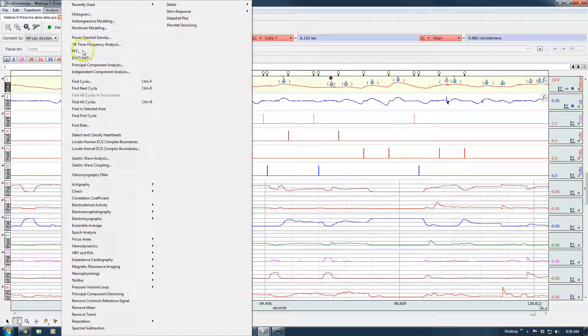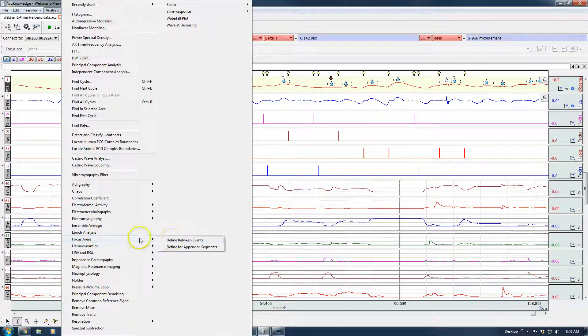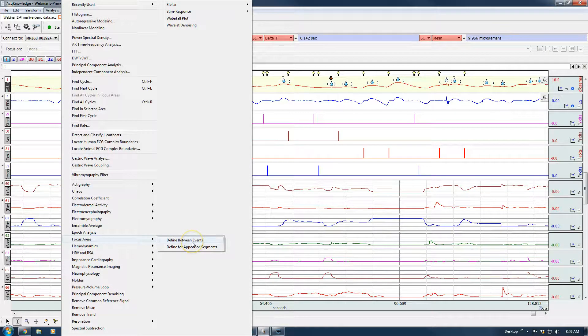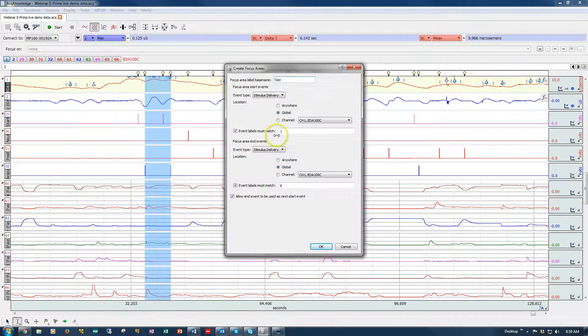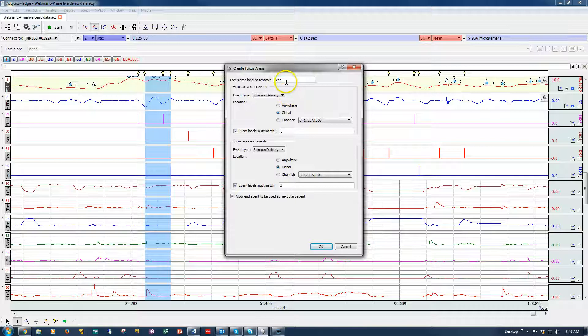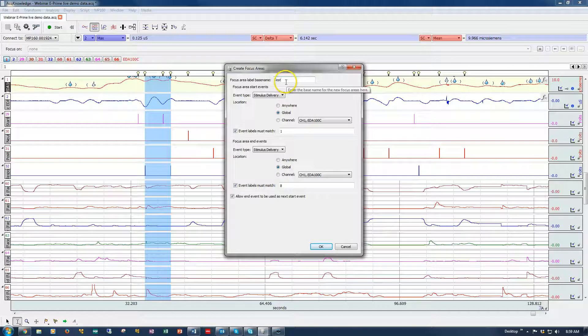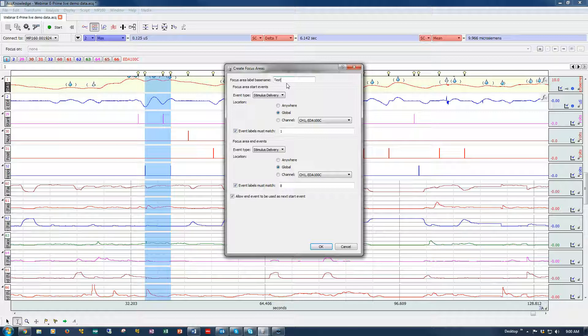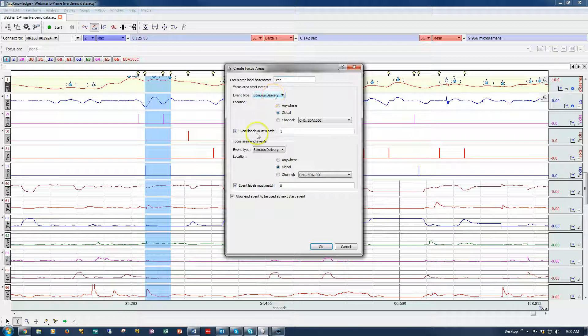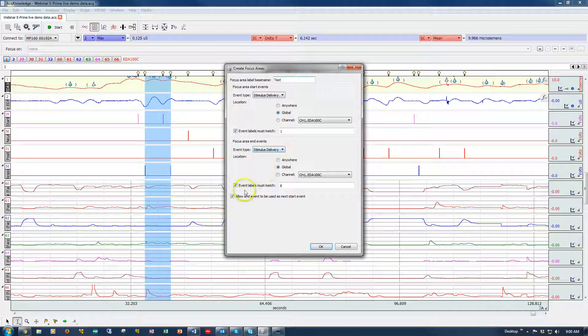So again, we're going to the Analysis menu, Focus Areas, Define Between Events. I'm entering a label. This is the label that will appear in each of the focus areas and it will number them. So it will say Test 1, Test 2, Test 3, so on and so forth. Stimulus delivery with a label of 1. Stimulus delivery with a label of 8.